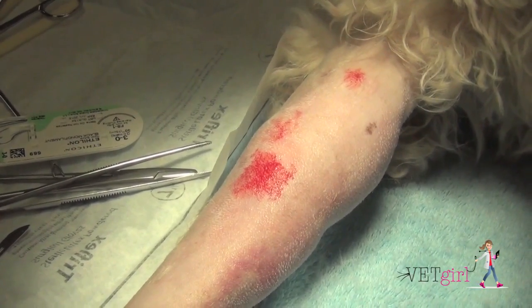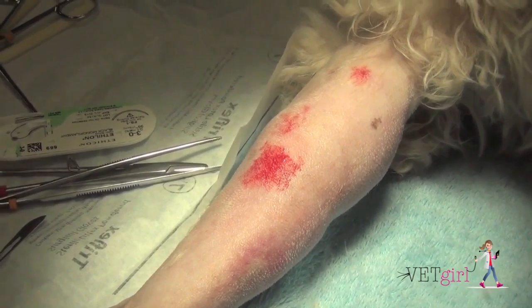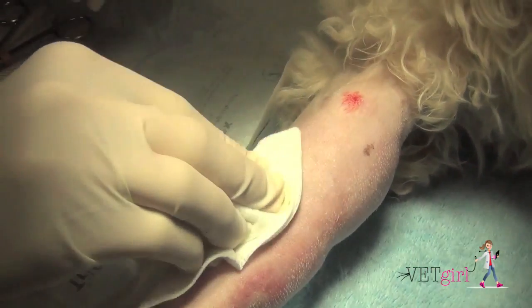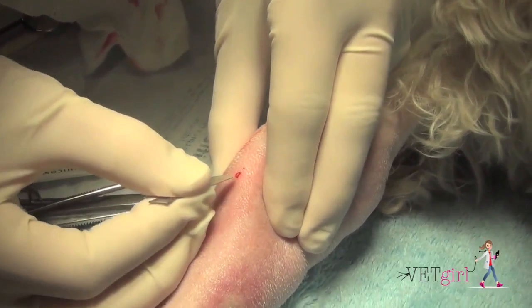In today's VetGirl video, we demonstrate how to treat an abscess and also how to place a drain. Today's clinical case is of an eight-year-old Goldendoodle who presented for forelimb swelling, lethargy, and fever.